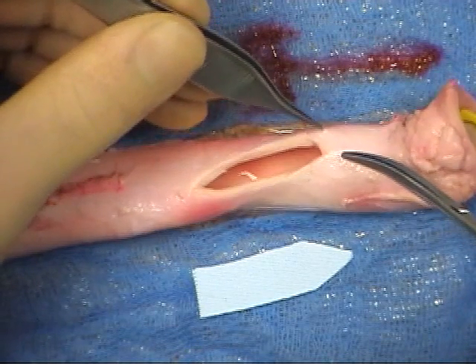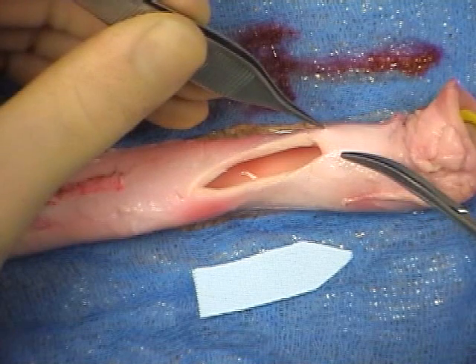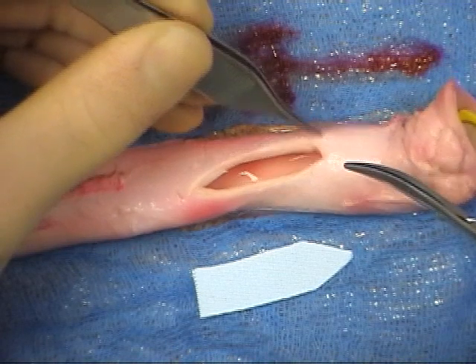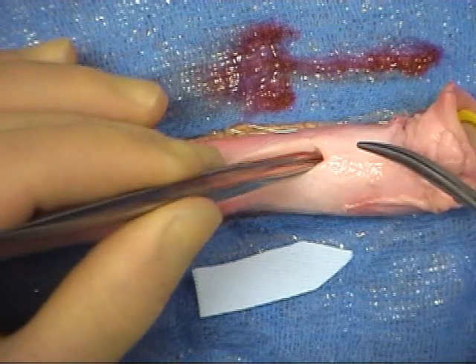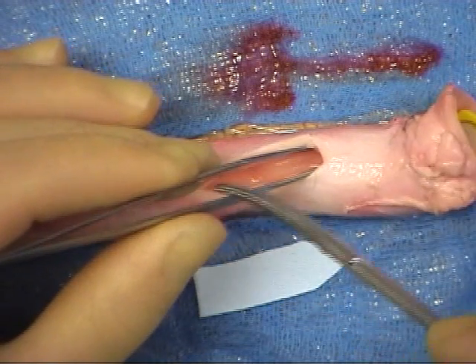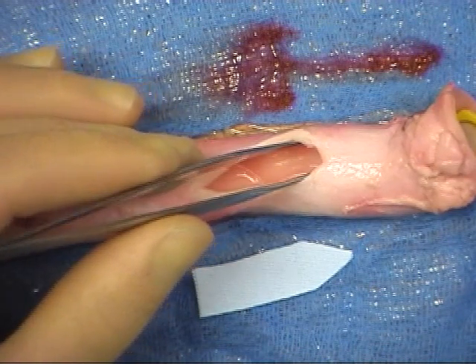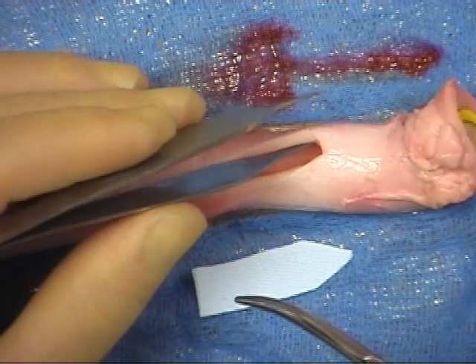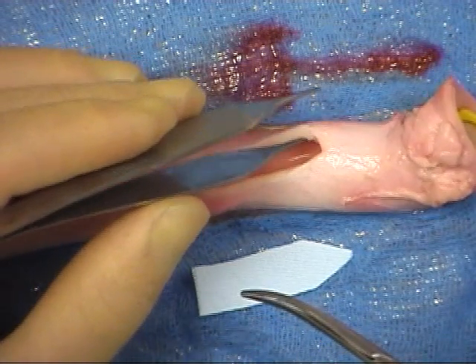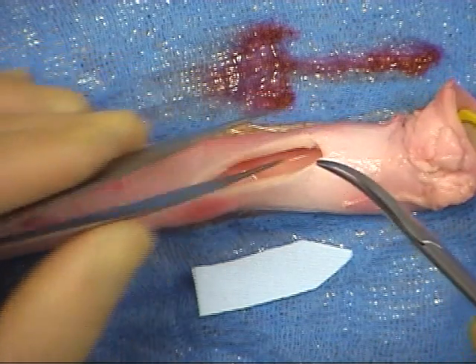In order to avoid damaging the intima of the vessel, there are a number of ways to handle the tissues with the forceps. The first technique involves grasping the adventitia of the vessel to stabilise the tissues for suturing. Next, the forceps are inserted into the vessel and the spring in the instrument used to hold the tissues apart. Finally, one limb of the forceps may be gently inserted to retract one edge of the vessel.